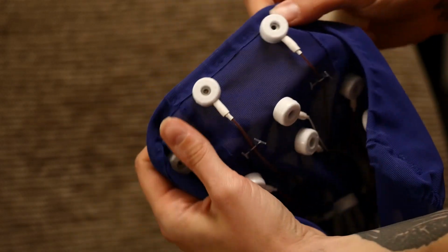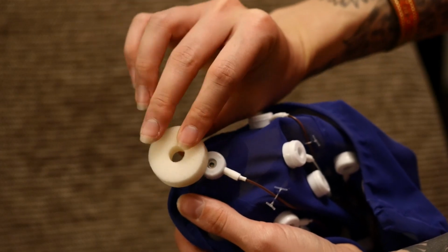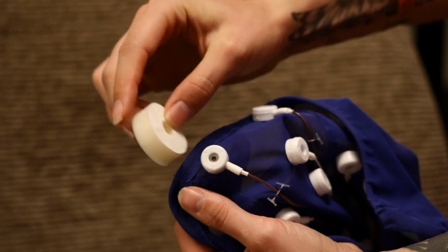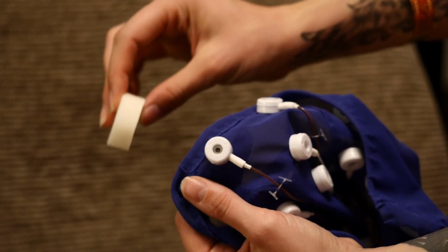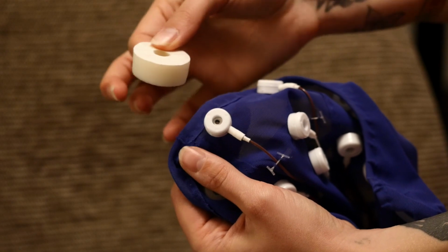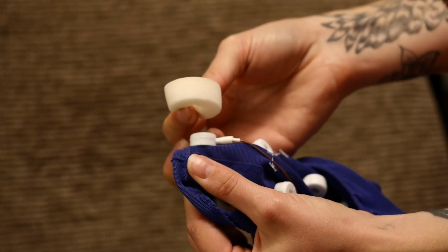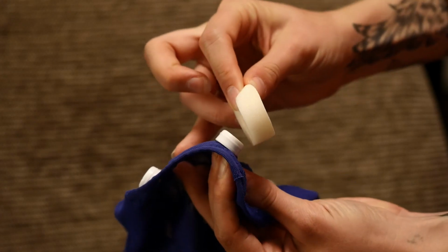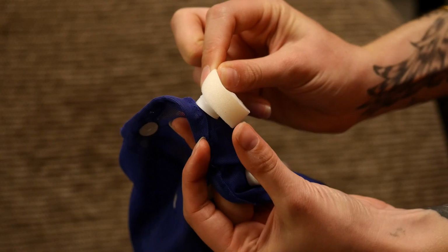So in order to do that, we're going to grasp our little sponge disc, and we're going to make sure that the sponge side is in towards the electrode and the paper side is towards the scalp of the client. And so what we're going to do is make sure that we hook the sponge disc onto the edge of the electrode like so. Hook it right there, and we're going to grasp it with our finger.